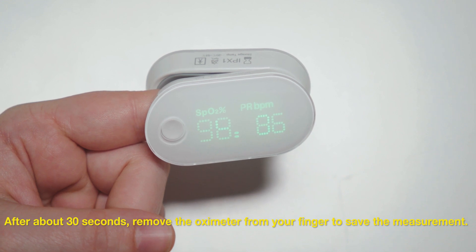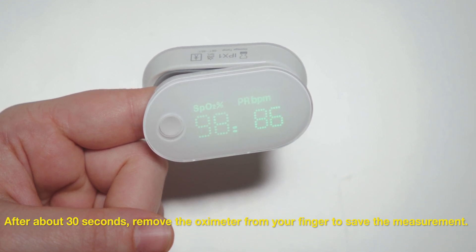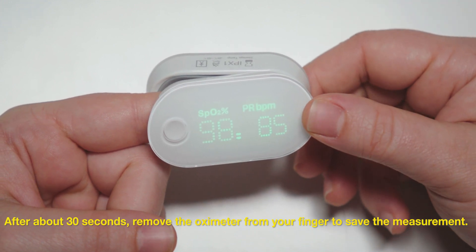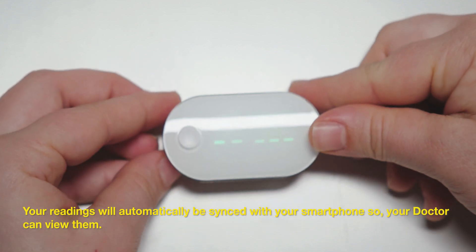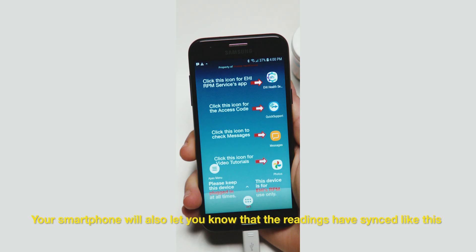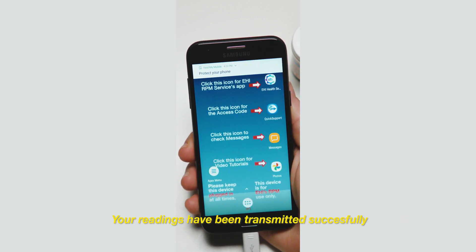After about 30 seconds or so, remove the oximeter from your finger to save the measurement. Your readings will automatically be synced with your smartphone so your doctor can view them. Your smartphone will also let you know that the readings have synced. Your readings have been transmitted successfully.